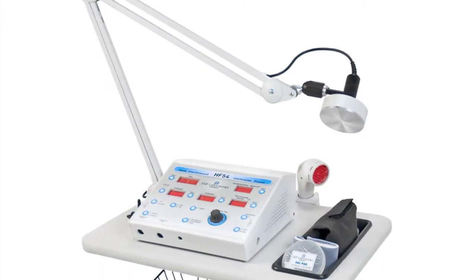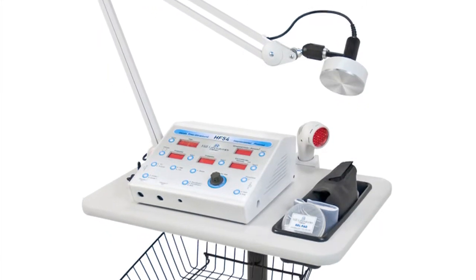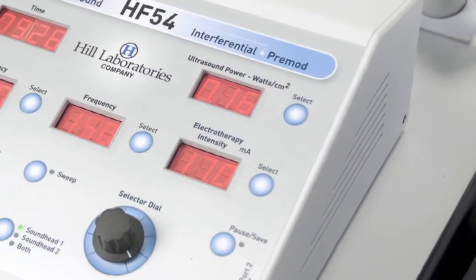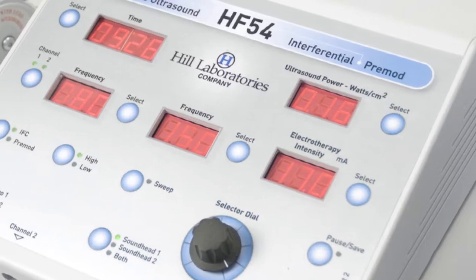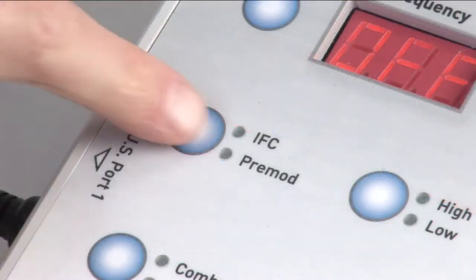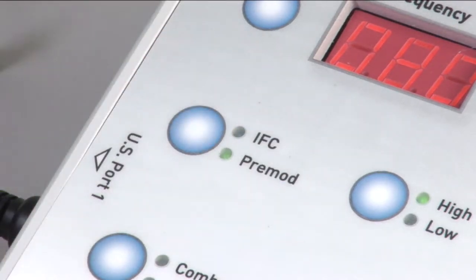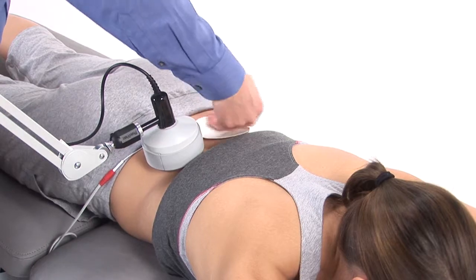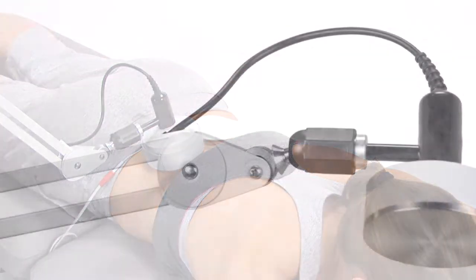The HF54 is the only ultrasound cleared by the FDA for hands-free stationary use. Using the HF54 hands-free ultrasound reduces operator fatigue and saves valuable staff time. The HF54 also features interferential and premod current, which can be used independently or in combination with an ultrasound treatment.